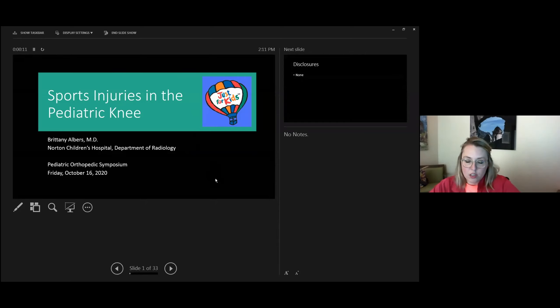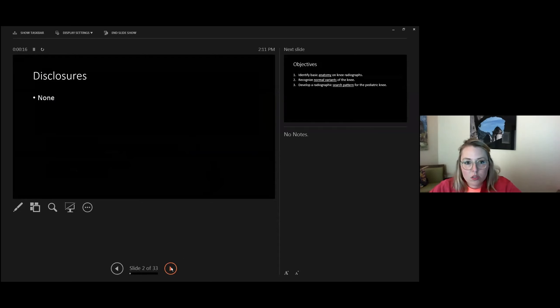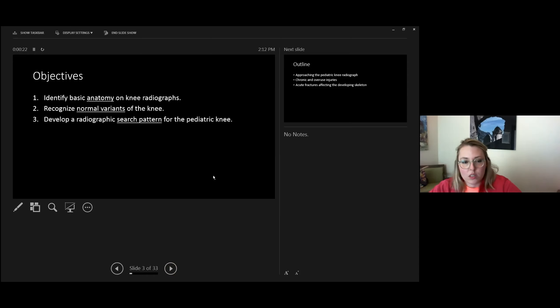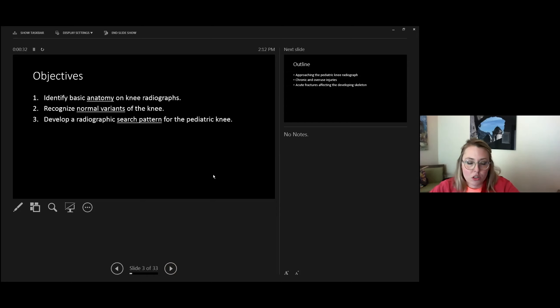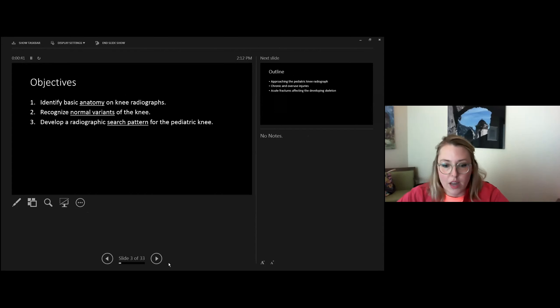Sports imaging in the pediatric knee is a specialized and very broad topic. We have three objectives today: identify some basic anatomy on knee radiographs, briefly talk about some normal variants that might give you pause when looking at an x-ray, and show some case examples of chronic and acute injuries to help develop a radiographic search pattern particular to the adolescent pediatric knee.